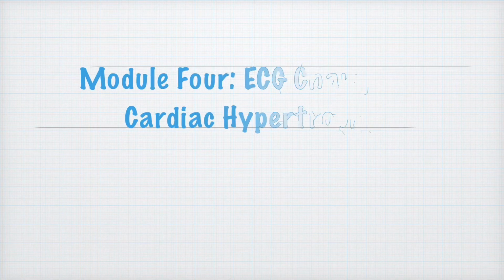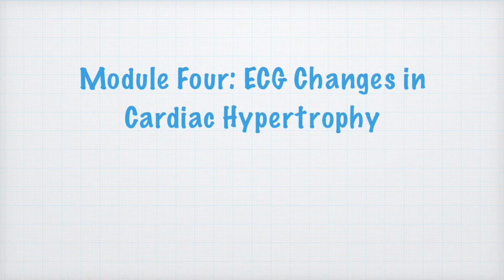Here we are back with our fourth module of the ECG series. In this video, we'll discuss chamber hypertrophy and their ECG changes.